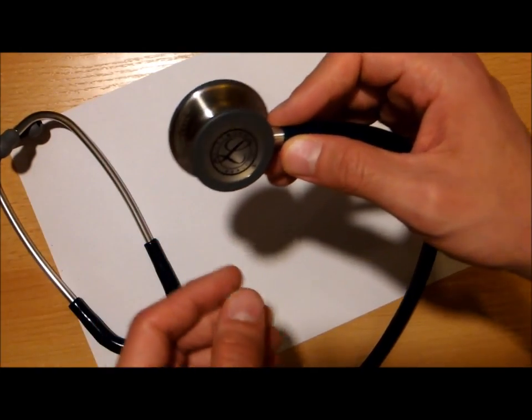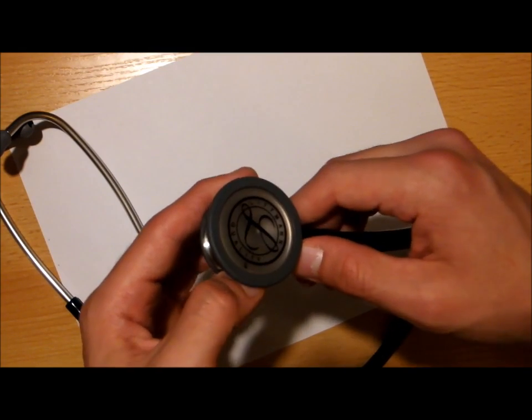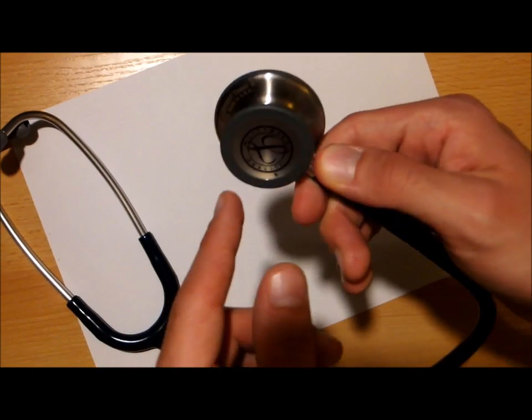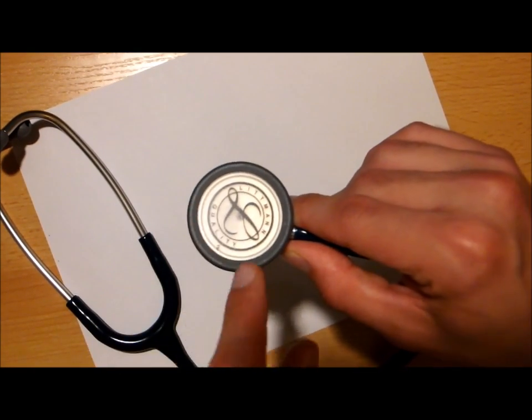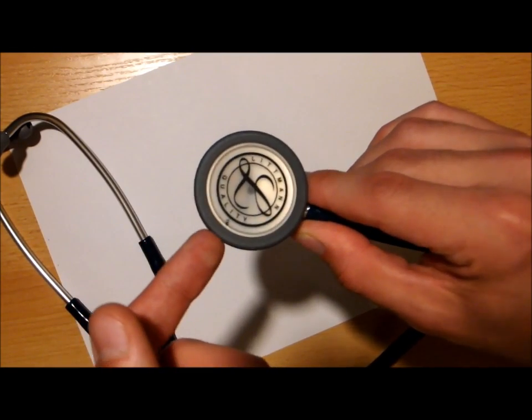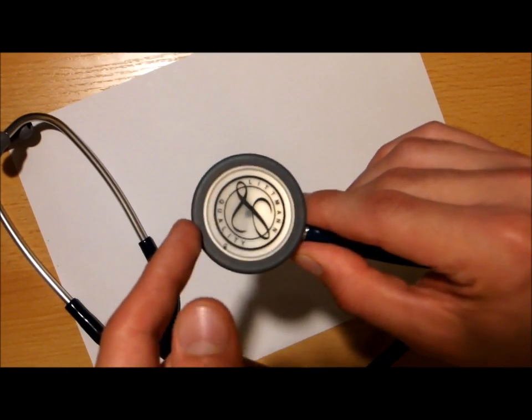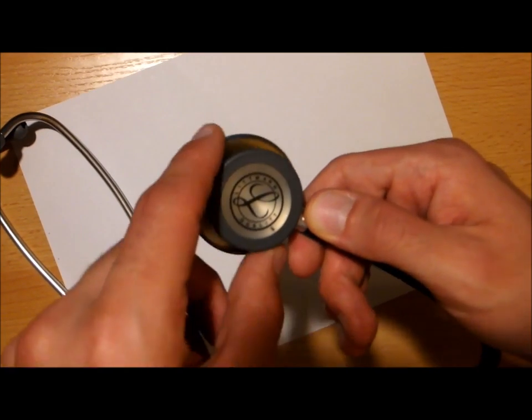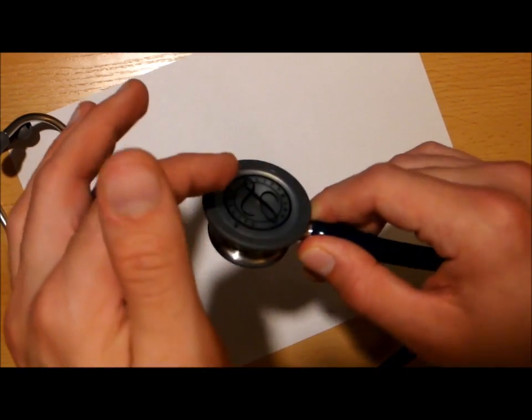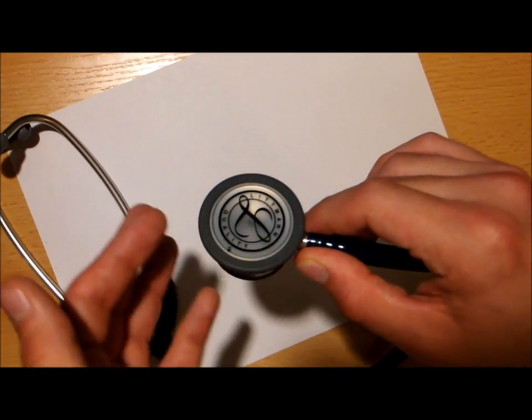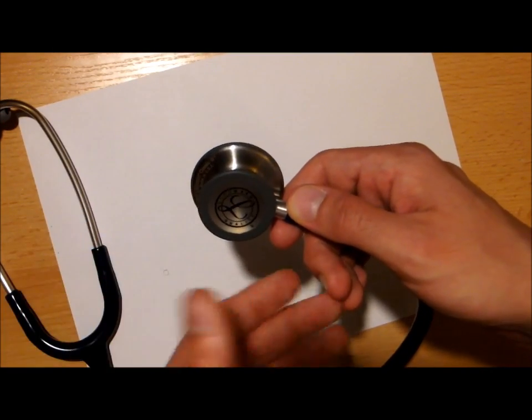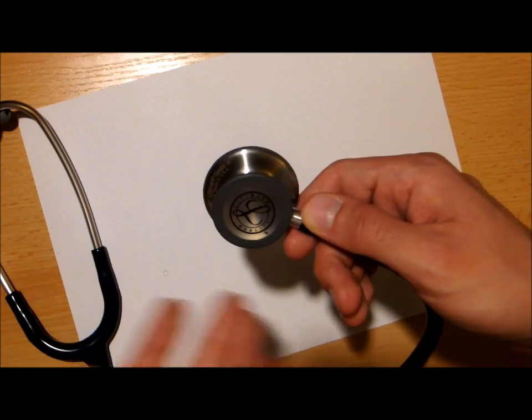I quickly noticed that this Littmann stethoscope has diaphragms on both sides. On one side we have the big versatile diaphragm, and the smaller one is for auscultating children, so it's just the smaller version of that big one in front. And I wanted to get the normal bell with a hole in it.